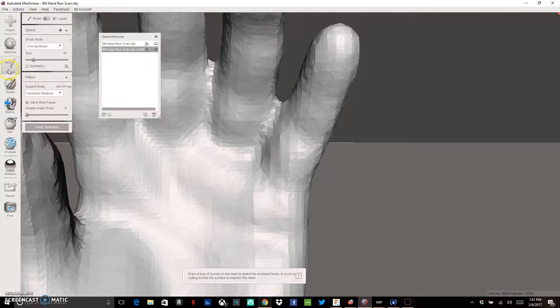To do that, go over to Select. That gives you a brush. You can change the size — make it bigger or smaller. We want a brush size that can get in between the fingers. About size 20 looks about right for my particular scan.